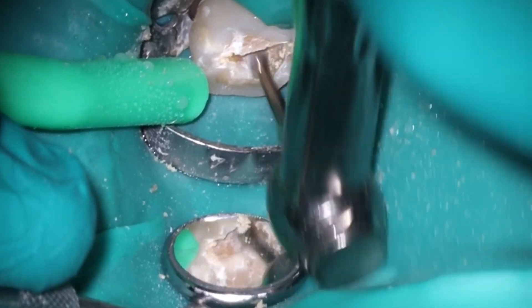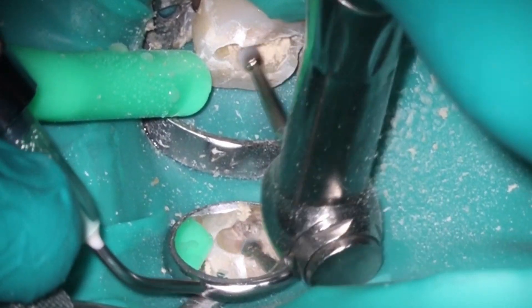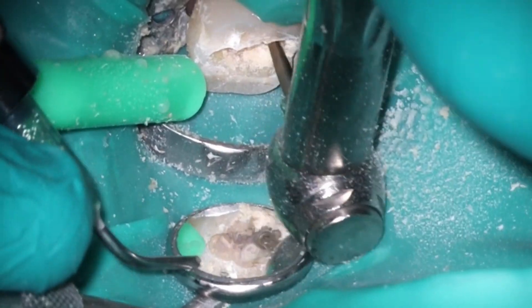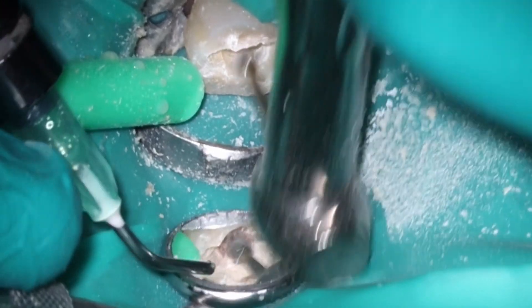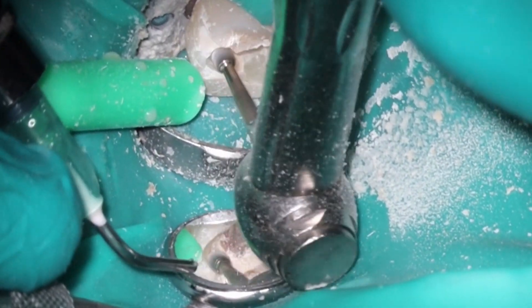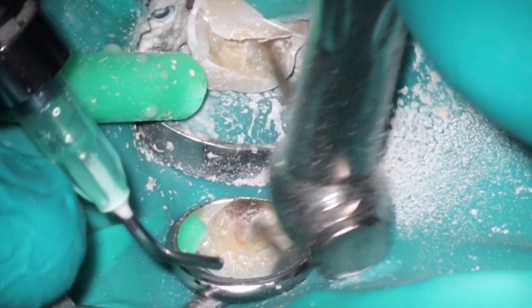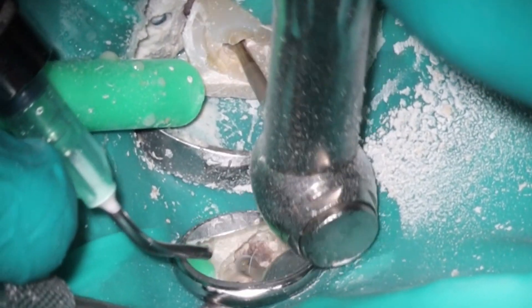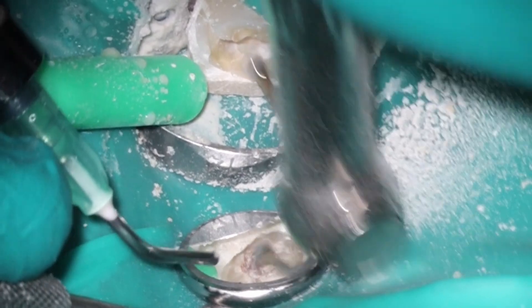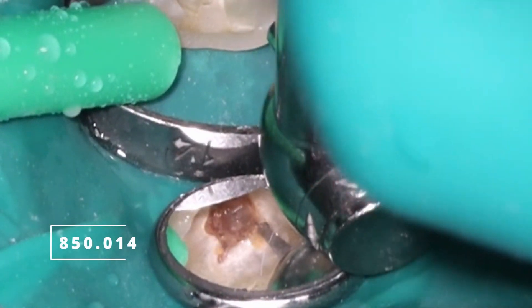As far as what we're doing here — clean out — you can see just how nasty that caries is when it's soft and leathery like that. It tells you it's pretty active, kind of angry decay. It's always interesting to me that there's almost a protective layer underneath the caries that goes right on top of the pulp tissue. In this case, obviously you're not doing vital pulp therapy because the tooth is dead. But interesting that the tooth does try to retain some level of vitality and tries to protect itself. But in this case there wasn't anything left, so you can see a lot of work just to get that nasty caries out.